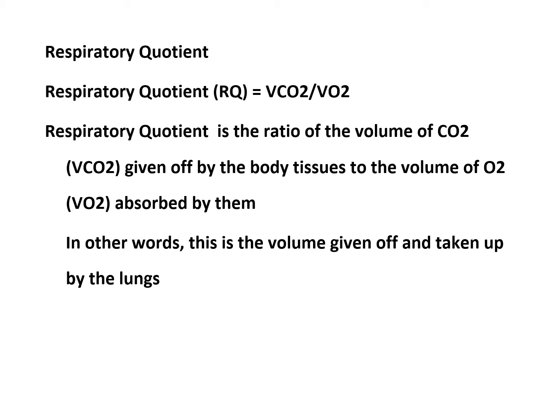If you take the actual normal values, VCO2 would be 200 mL per minute divided by 250 mL per minute of VO2, which gives you 0.8.